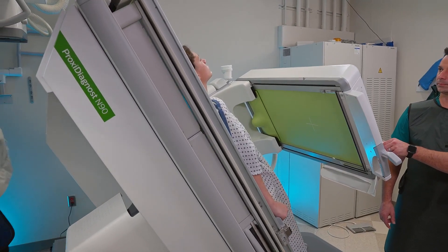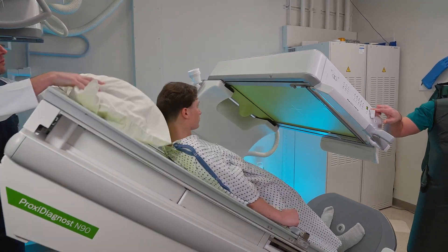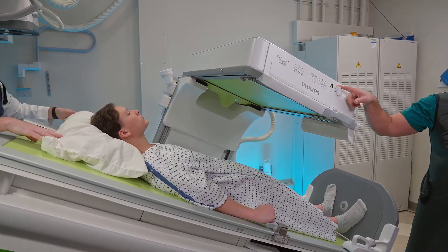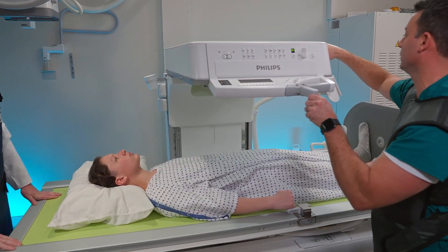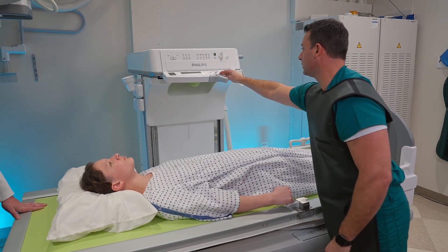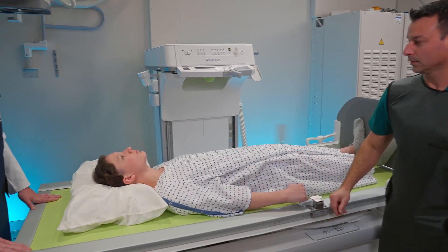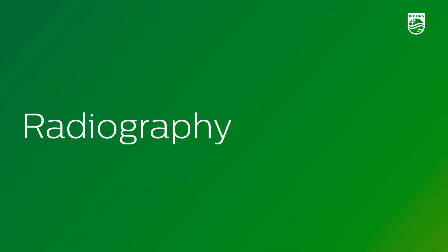Once we're done with the study, we're going to go ahead and lay our patient down, tilt the table down, go ahead and park the tower, and the study is complete. We've gone over the fluoroscopy — now we're going to go over the general x-ray portion of the system.